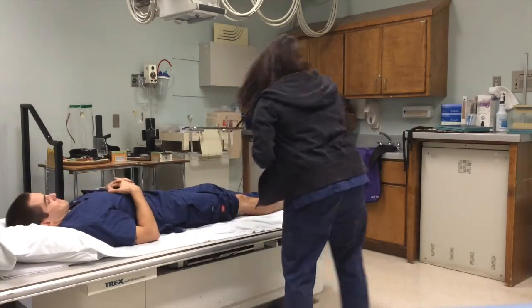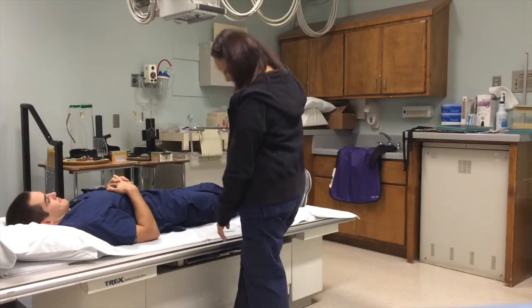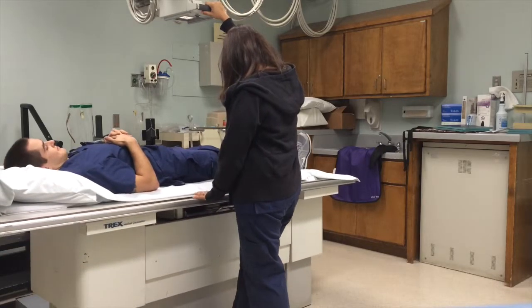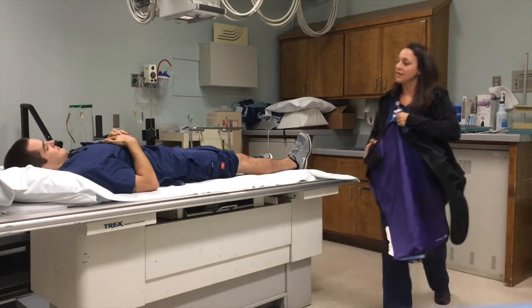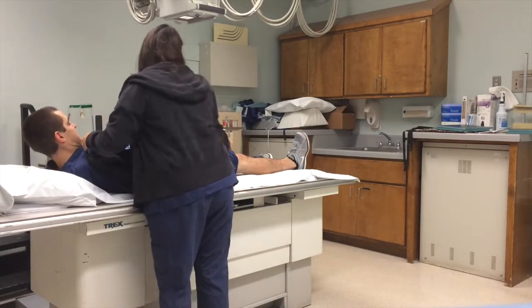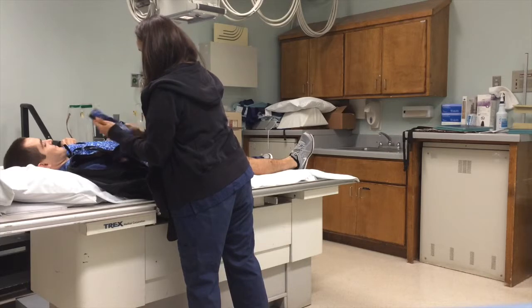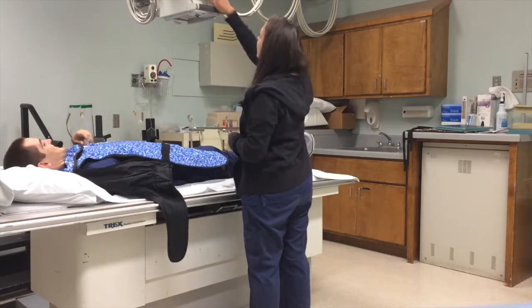I'm going to go ahead and start by raising the table. So hang on just a sec, a little bit of a roll. There we go. Before we get started, I'm also going to shield you now that you're easier to put this on because you're higher. Sorry, it's a little heavy. And I also have this to go around your neck. There you go. Sorry if it's uncomfortable. Won't be long.